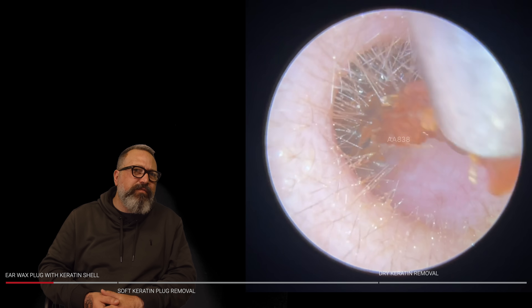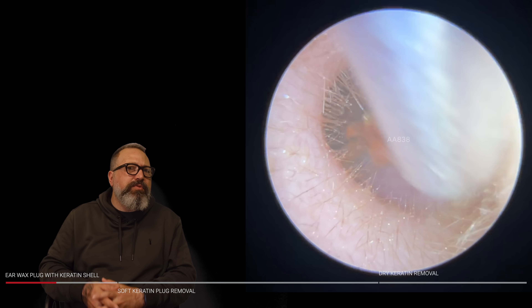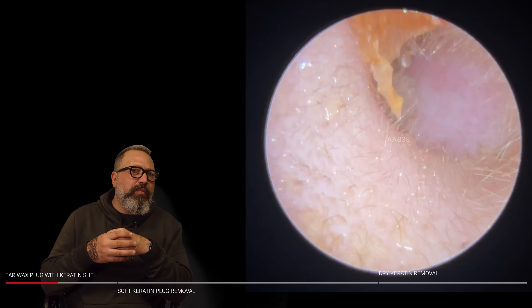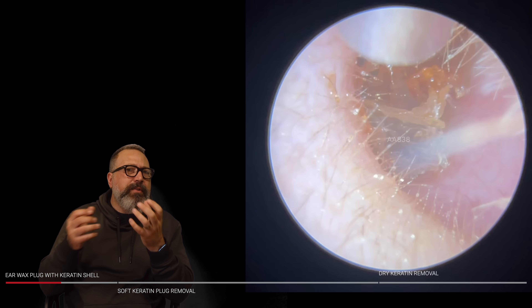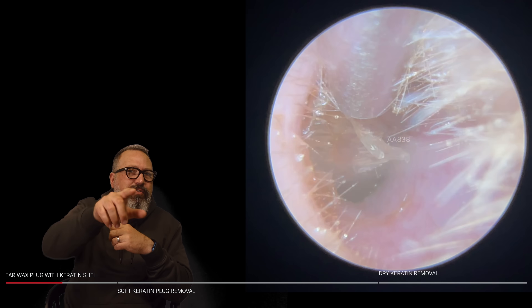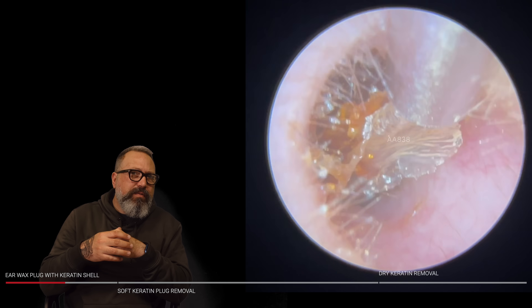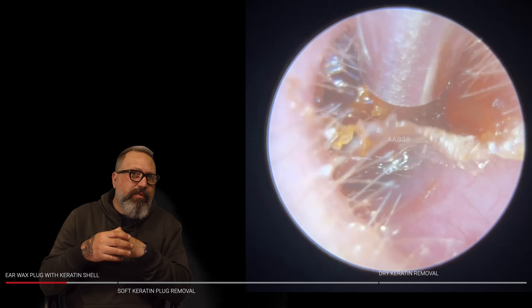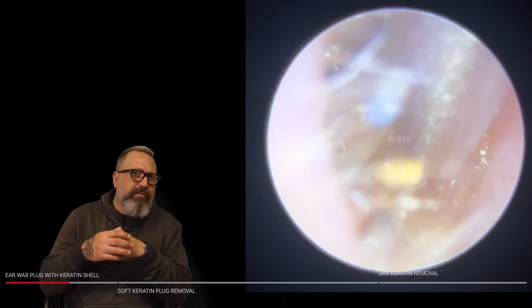It's keratin. So this front section looks more like keratin now, and I've lifted from the side. I think this was almost like a shell of keratin around the wax plug. You can see that sort of tail of it going off there. It tends to put up a little bit more of a fight, a little bit more resistance. You can really see where it's lifted at the entrance. You can see at the bottom of the screen there's this whole kind of layer of keratin around that outside edge.